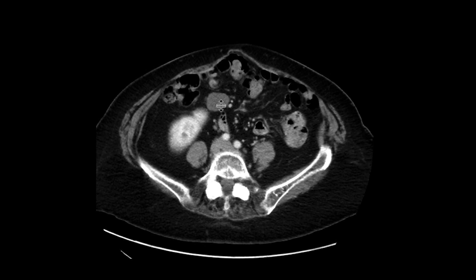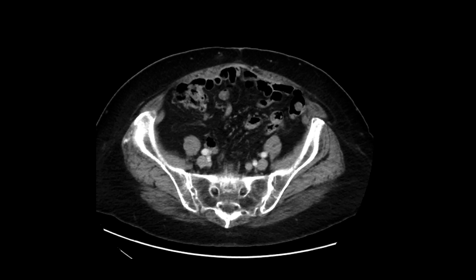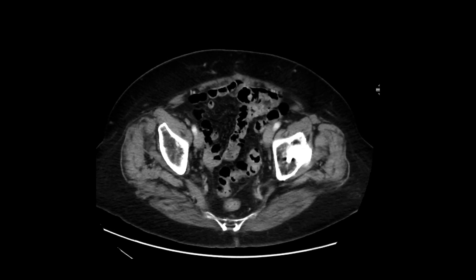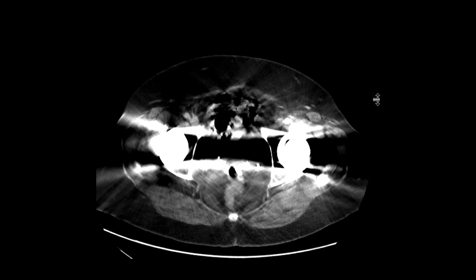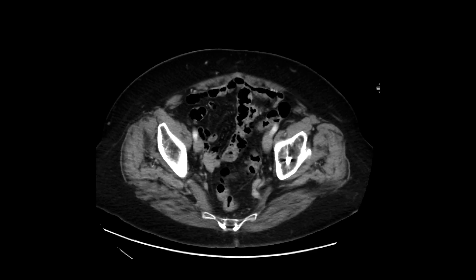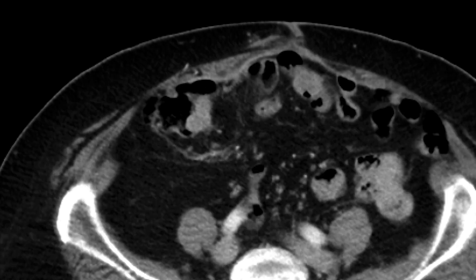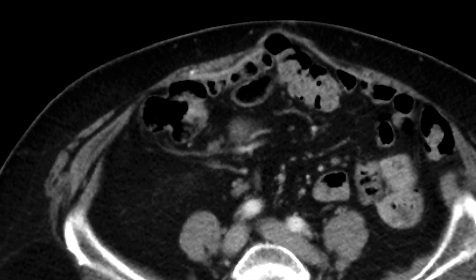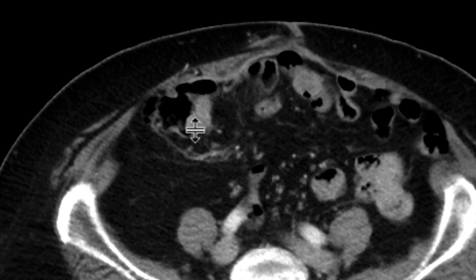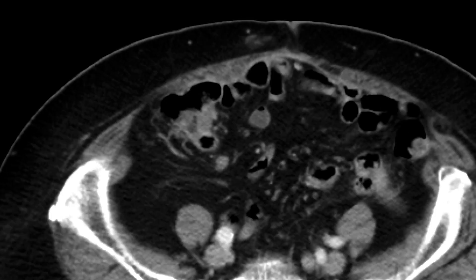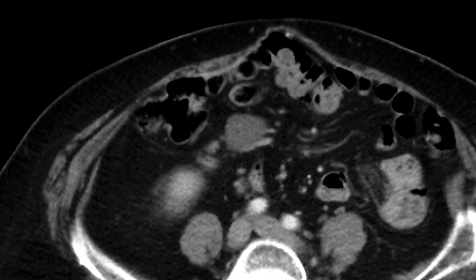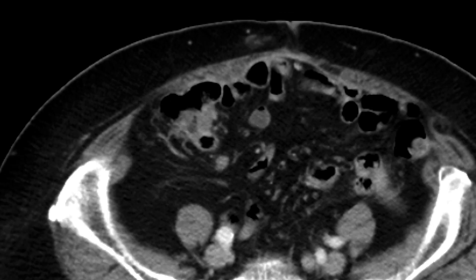There's this mesenteric mass over here. But the point I wanted to share with you is, if we look at the bowel — and this can be very tricky, certainly in the pelvis it's very tough because of the hip prosthesis — but right around the cecum over here, we can see that there's a little bit of asymmetric soft tissue thickening surrounding the medial aspect of the cecum. This is the sort of finding that you can scroll through very quickly and miss, and perhaps on a good day you'll catch this.